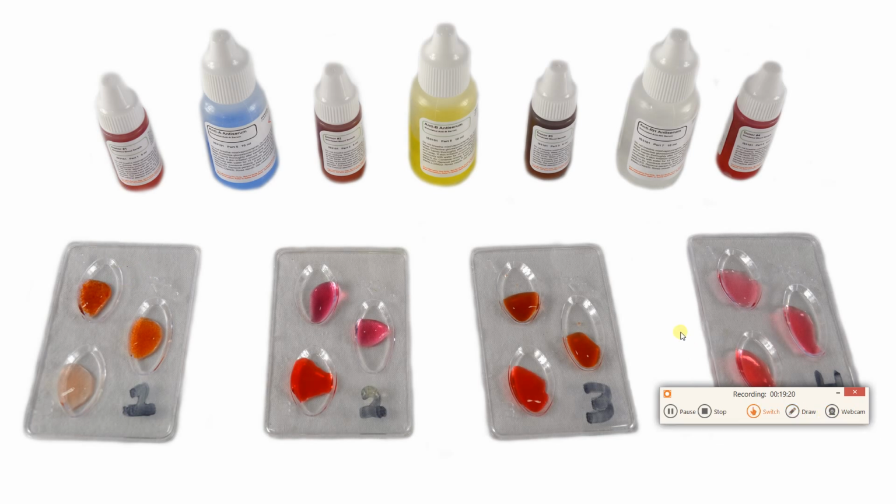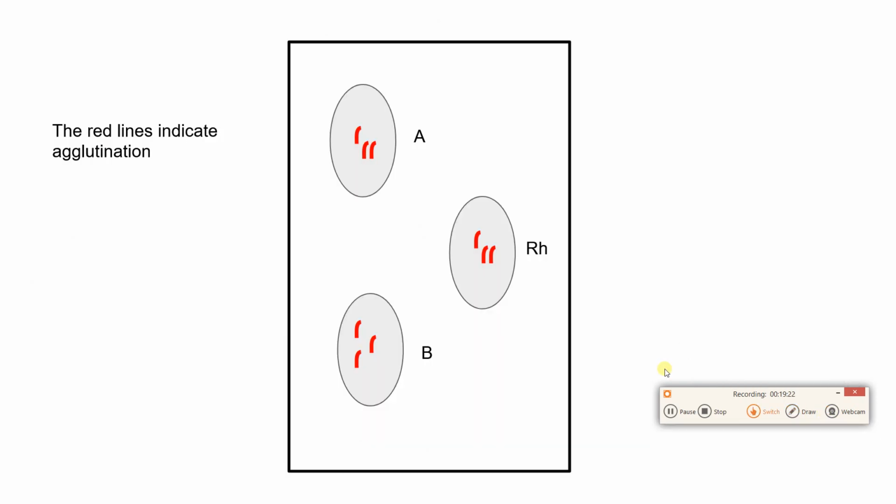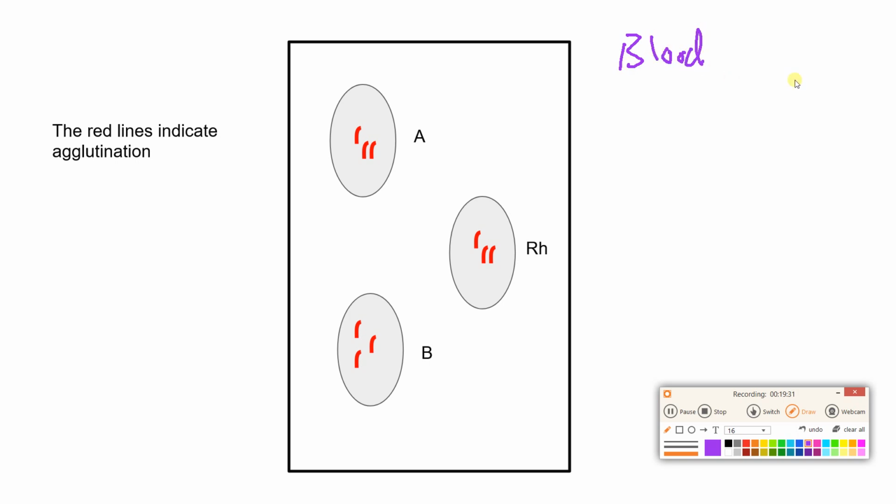All right, let's walk through some possible situations. What I did here is I put the same blood sample in all three of these wells.